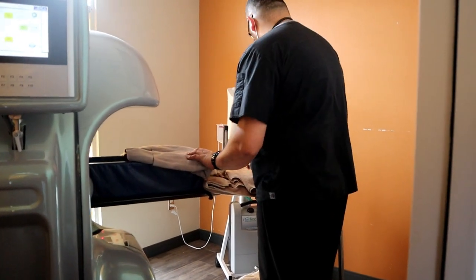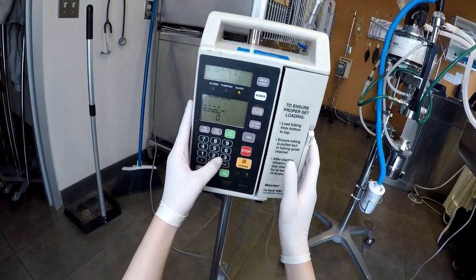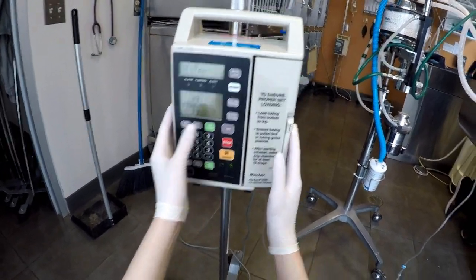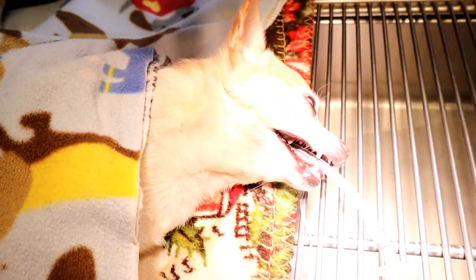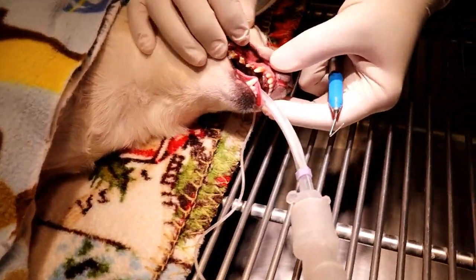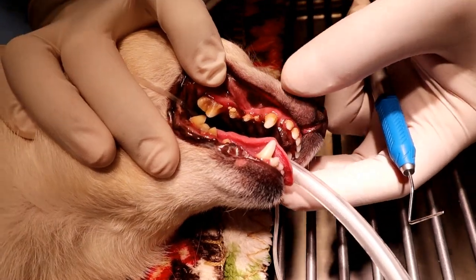After running the CT, we're good to move her back to our dental suite and get her hooked up to her IV fluids. CT looks good. No obvious extractions so far. Nothing obvious. You have to take that into consideration while you're doing your exam.